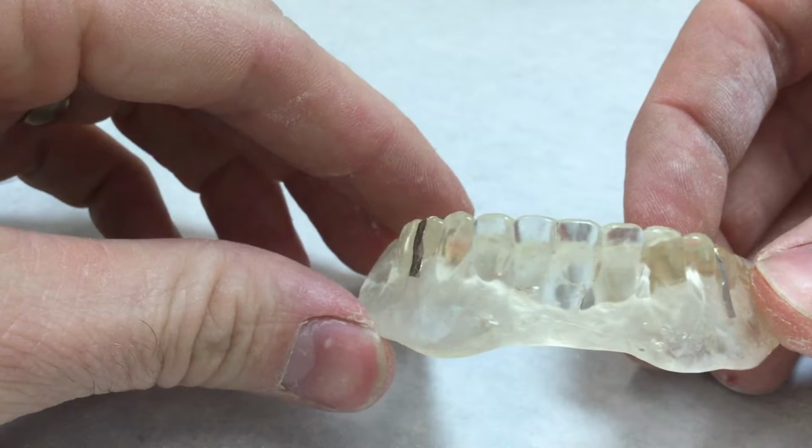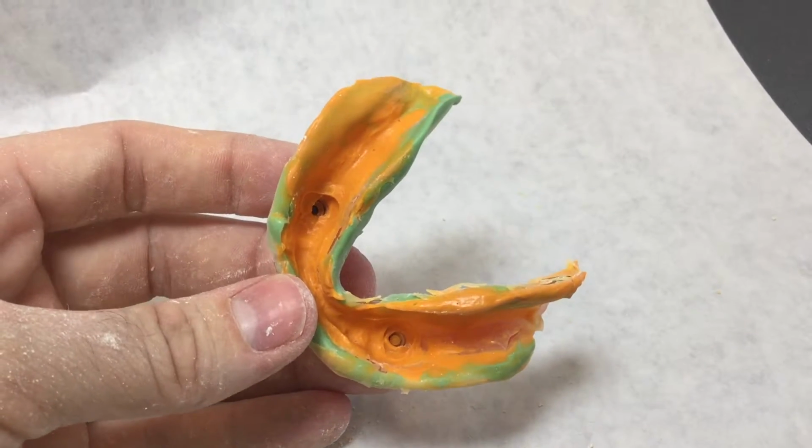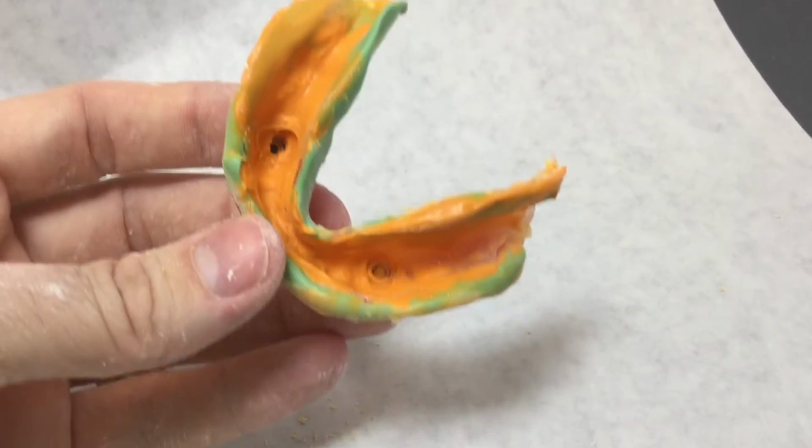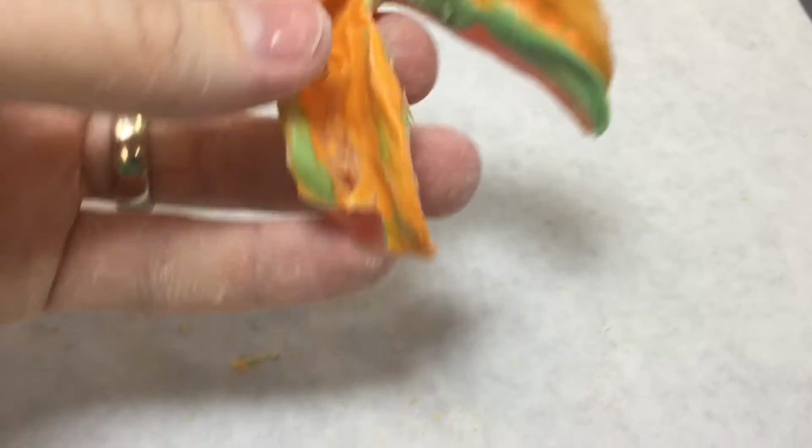The fabrication of an edentulous radiographic guide begins with taking impressions. In most instances, implants are recommended on the mandibular arch. This is to aid in the resistance and retention of the lower denture.